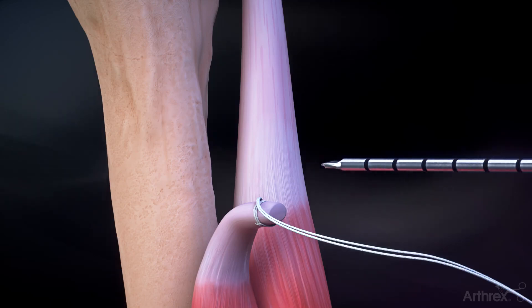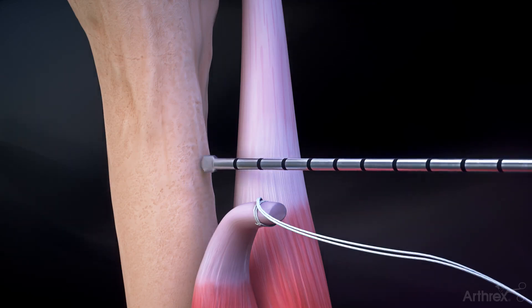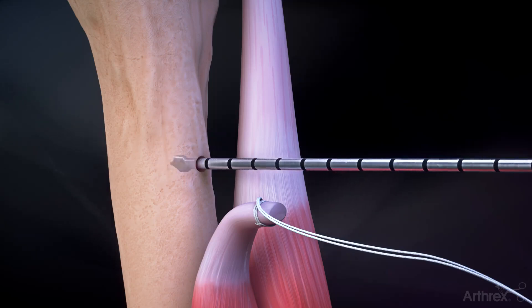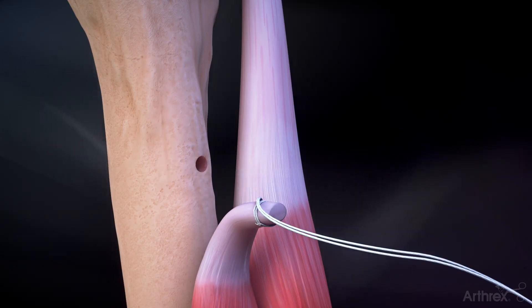Place the drill at the desired location on the bony surface of the proximal humerus and drill a unicortical tunnel using the 3.7 millimeter spade tip drill.